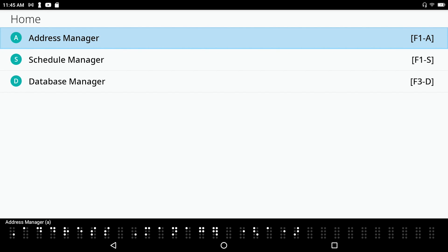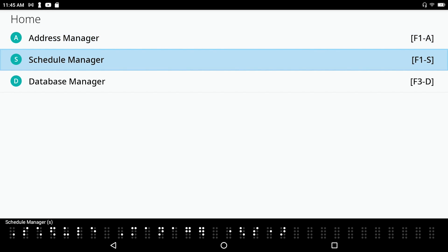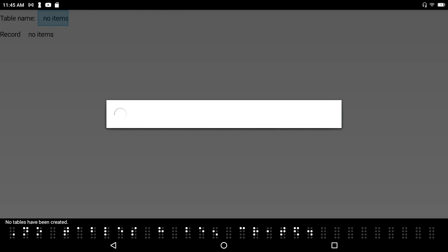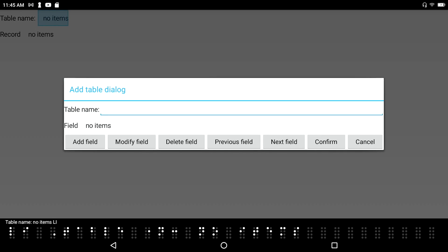Address manager — A. So the first item in the organizer folder is address manager. Space dot-4 down. Schedule manager — S. Database manager — D. And there's database manager. I hear 'no table has been created.'